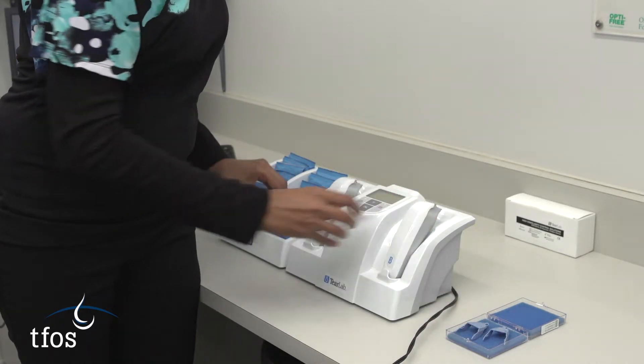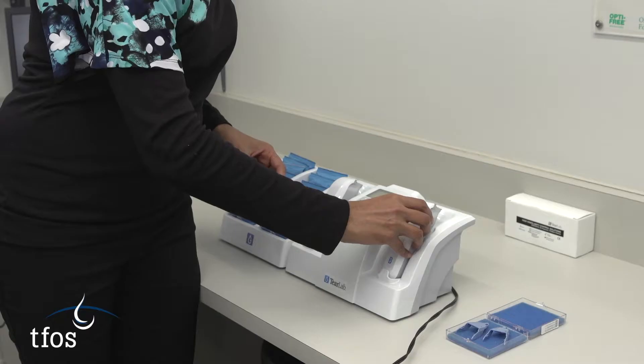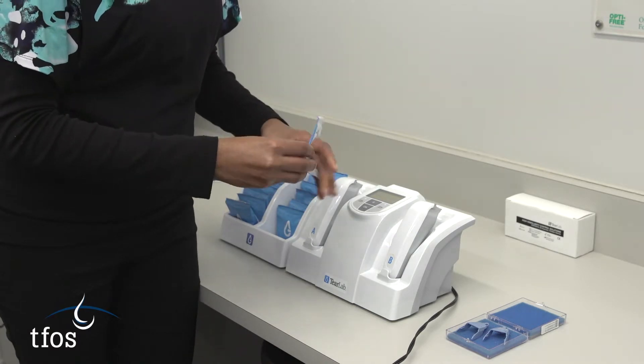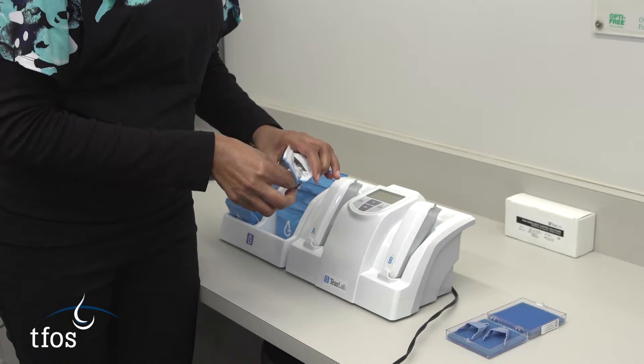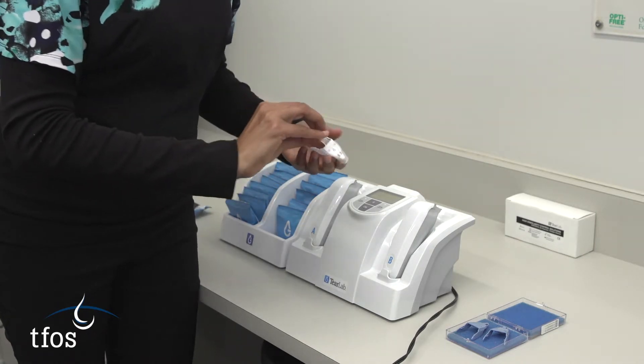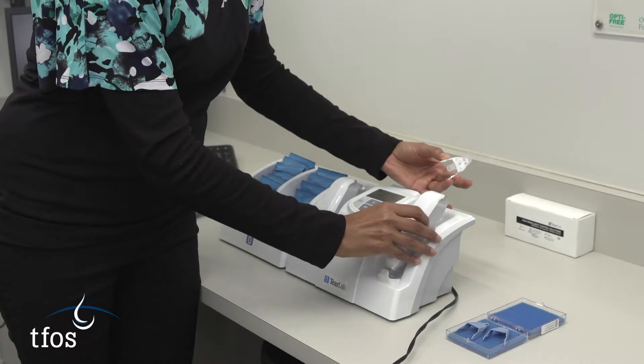With the device ready to be used, the patient is seated comfortably and the procedure explained. Opening the sealed packet will reveal a new test card with a plastic cover, which is then clipped into the osmometer pen. When this is positioned correctly, a beep will sound and a green light will become visible on the pen.